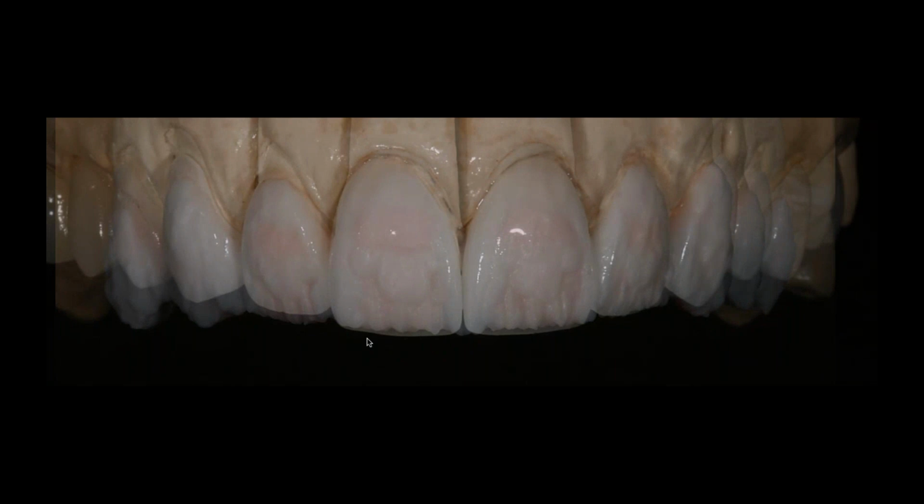So I've now put my ceramic over the outside of that as a veneer. I'm thinking of the ceramic more as a veneer. And if it's really translucent, it's going to show me everything that's inside. If it's really opacified, it's going to hide some of the things that are inside.